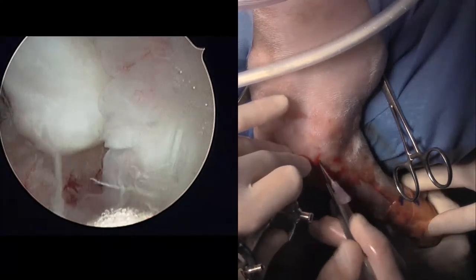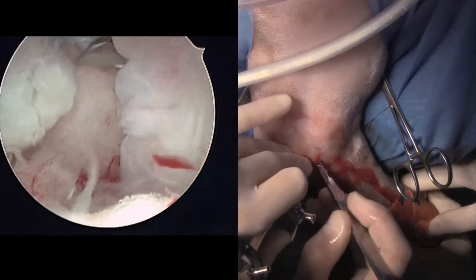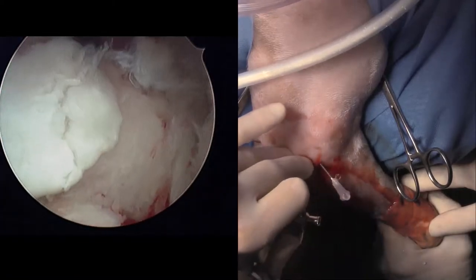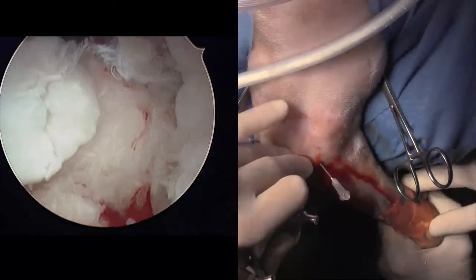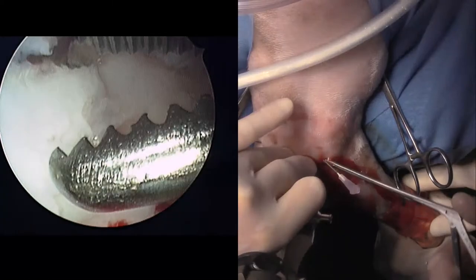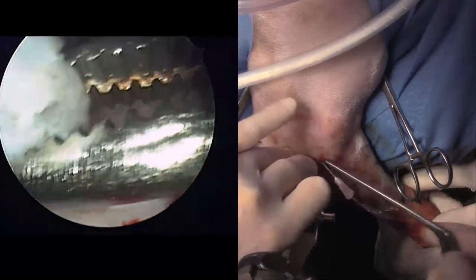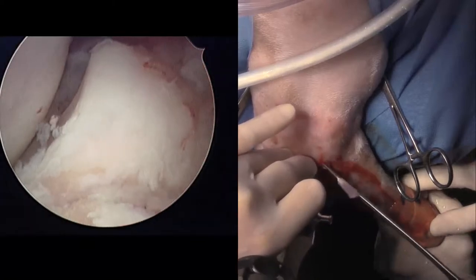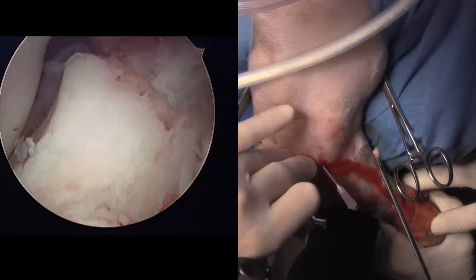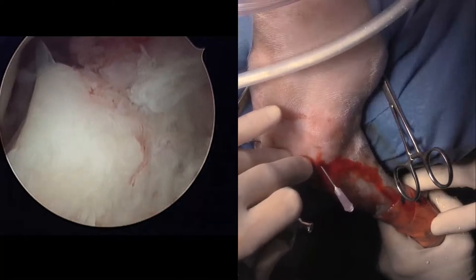So I'm going to cut along. You can see the blade sitting right there. And then I'll reach in alongside. So there's my grasper. And I've got the fragment there. I'll just gently try to pull that out. There we go. So that's sitting right there. I don't know if you guys can see that. That is probably the easiest arthroscopy I've ever done.